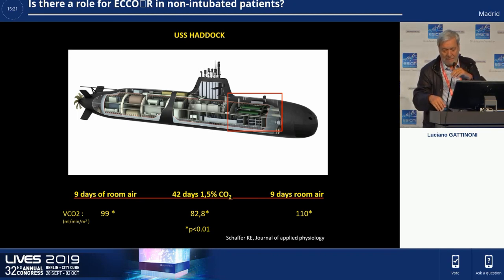Try to imagine that we decrease the CO2 reserve for 3-4 days, and then the patient is back a little bit more active, and so on. So I think there is a possible basis, the CO2 removal in this way, for a different physiological approach to the COPD patient, as Kolobov imagined about 40 years ago. Thank you for the attention.